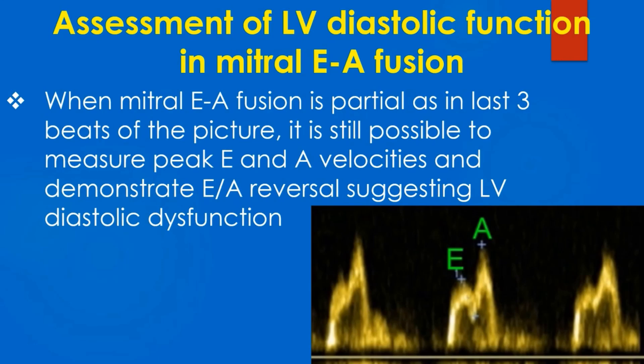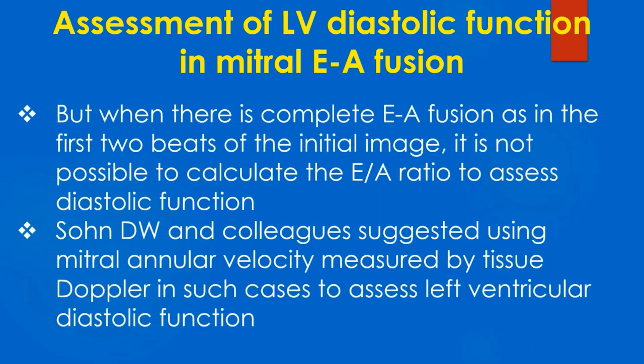When the mitral EA fusion is partial, as in the last 3 beats of the picture, it is still possible to measure peak E and A velocities and demonstrate E by A reversal, suggesting left ventricular diastolic dysfunction. But when there is complete EA fusion, as in the first 2 beats of the initial image, it is not possible to calculate the E/A ratio to assess diastolic function.